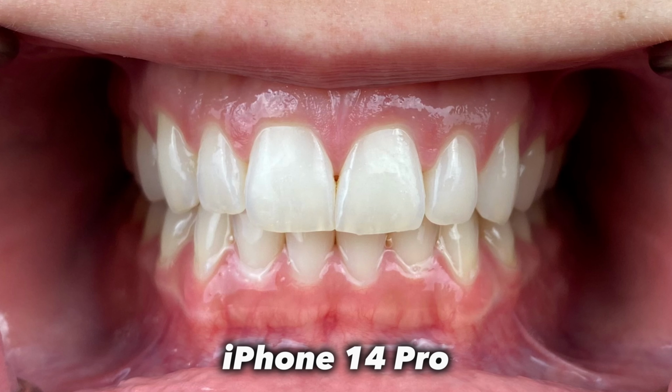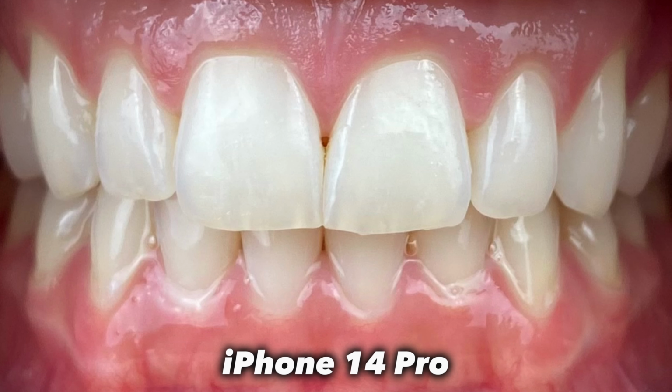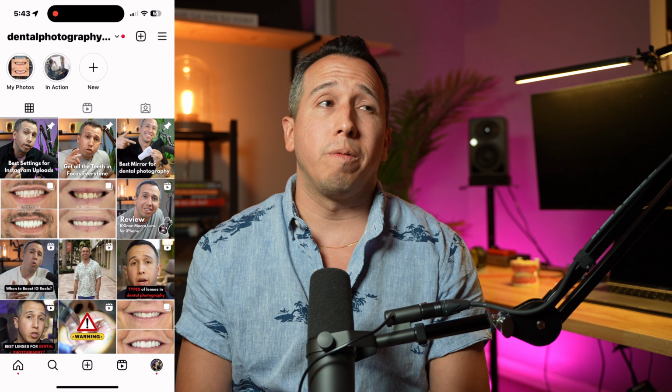Just take a look at these pictures that I have. This one was taken with the iPhone 14 Pro with the native lens, and this next photo was taken with the Sony a7 III with the 90mm 2.8. You can clearly see that if you look along the margins, that's where it starts to fall apart, and that's where I can't really use this, because a lot of patients will zoom into the teeth and look for the quality. Yeah, you can. It does have some raw photos that you can edit, but it's still not the quality that you would get from a mirrorless camera or a DSLR.